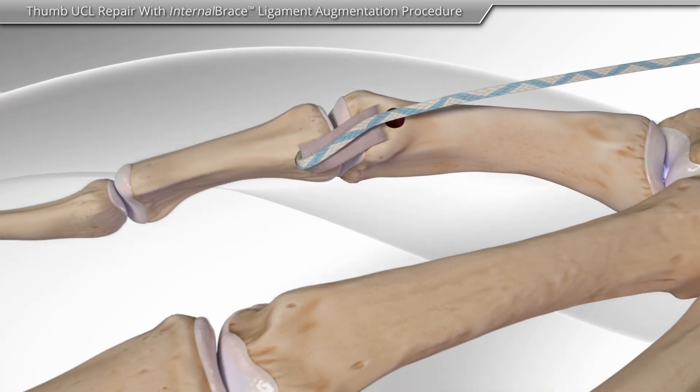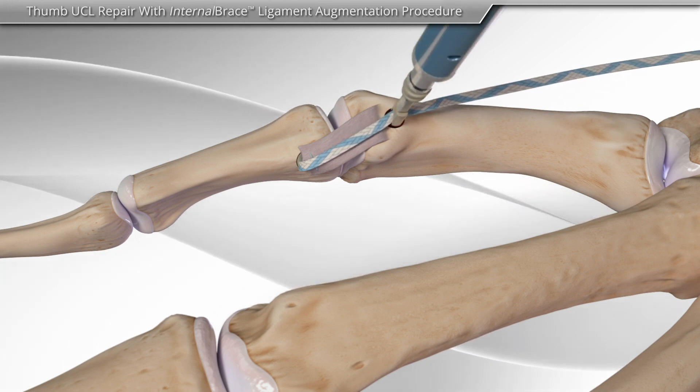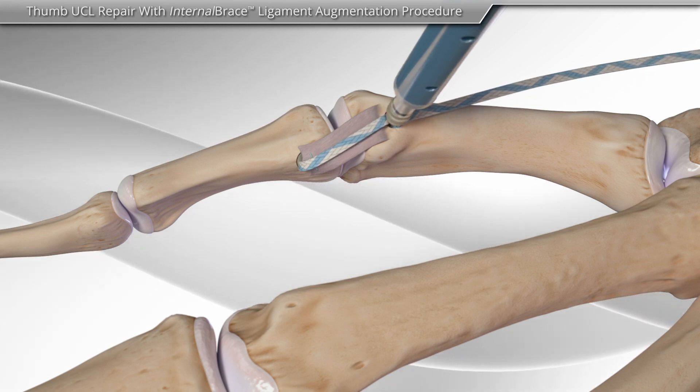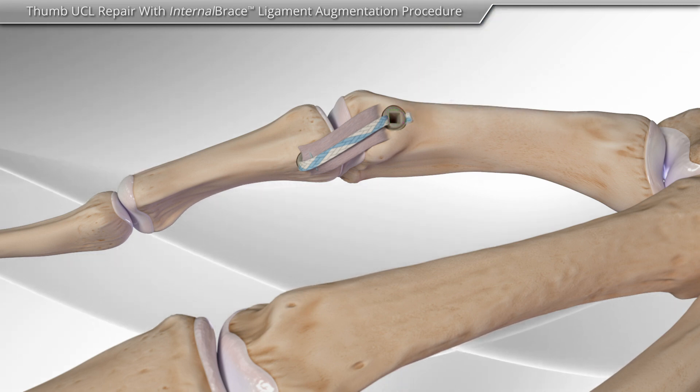Next, the suture tape is brought across the joint and inserted into the remaining socket to help support the repaired ligament. The excess tape is cut, completing the Thumb UCL repair with internal brace ligament augmentation.